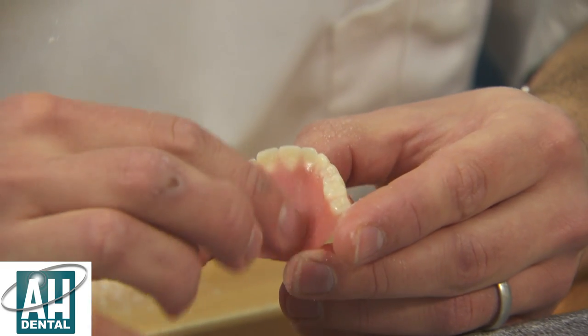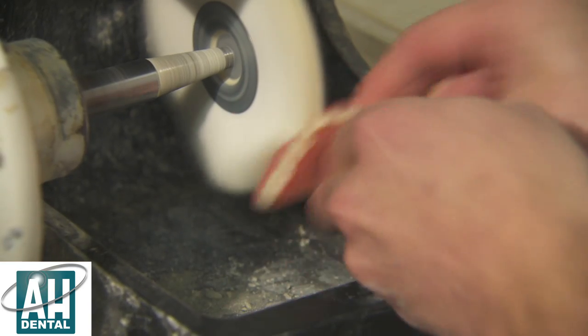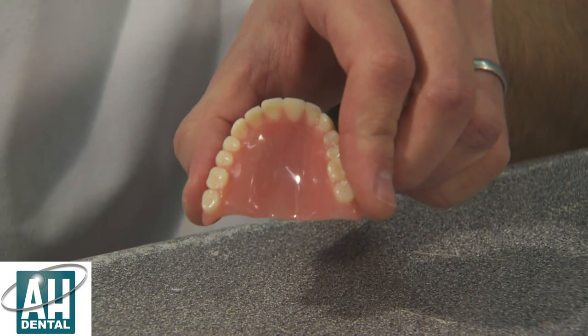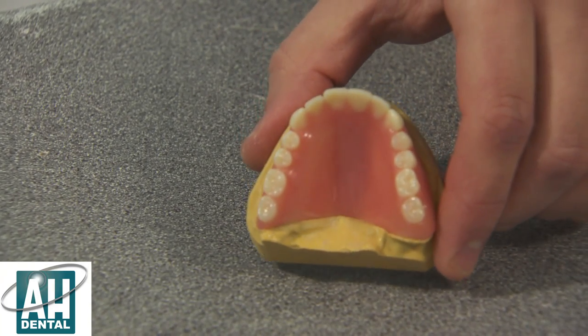Now we've got the repair nice and smooth, it's ready to be polished. The denture is now fully repaired and ready to go back to the patient as good as new. There are kits out there that you can buy to do it yourself, but you cannot beat a professional denture repair.